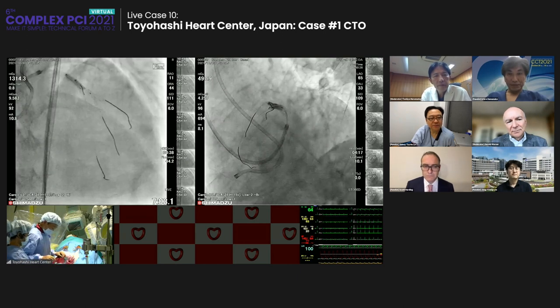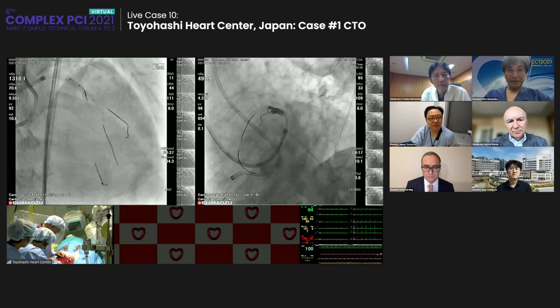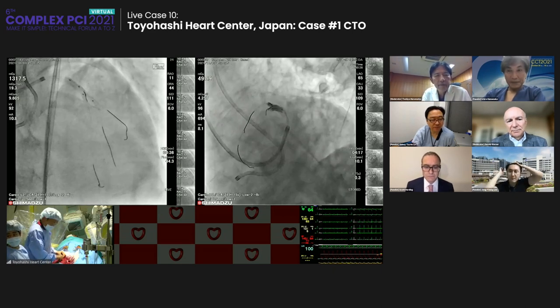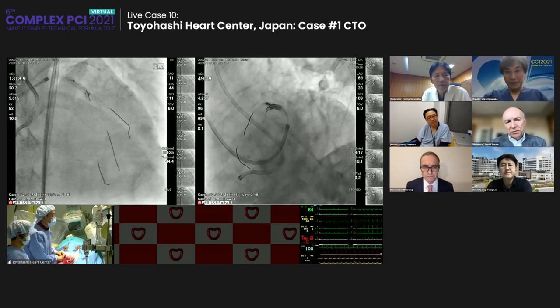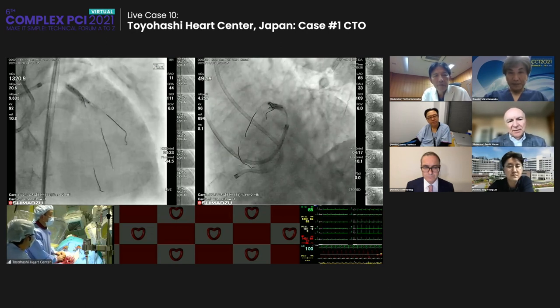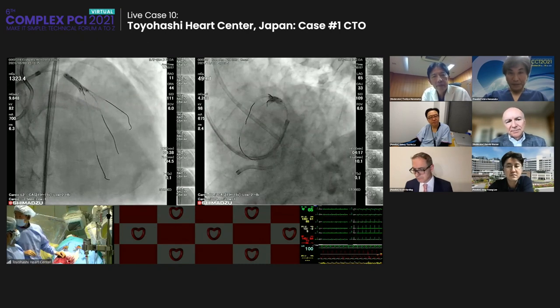I guess because you do a lot of imaging. The imaging check at the end, that you've actually achieved a good result, would probably ensure that you get the best result possible. So I think that's probably another thing too, is to image both. And it's important to do the optimized POT distally enough. That's a mistake often done, that you don't get the POT distally enough.